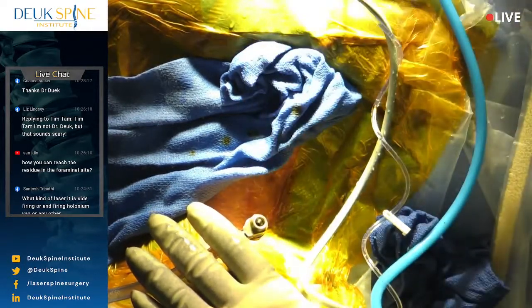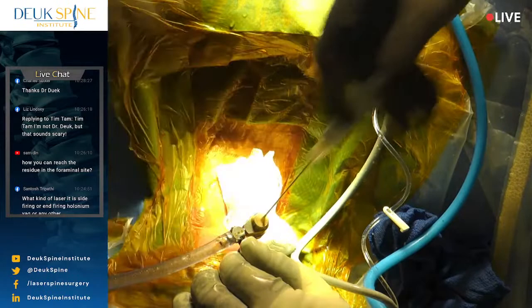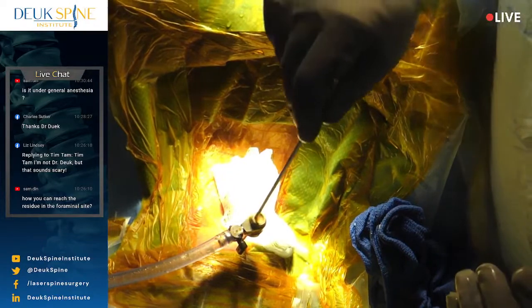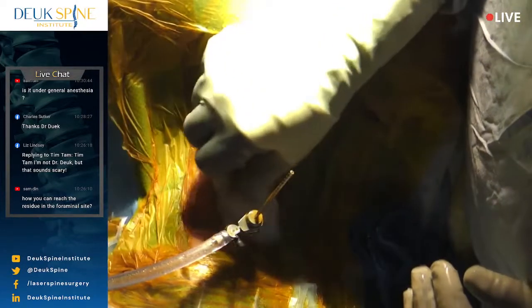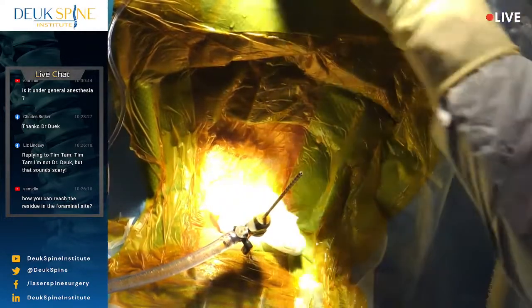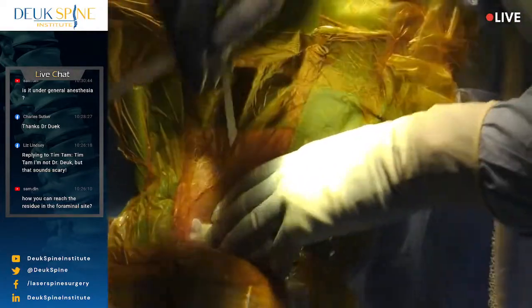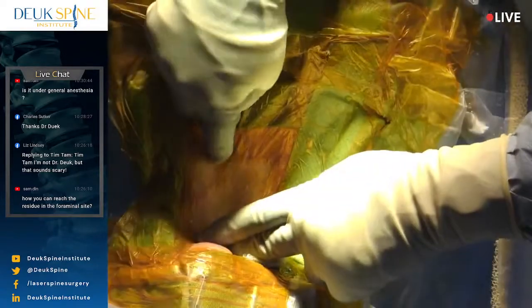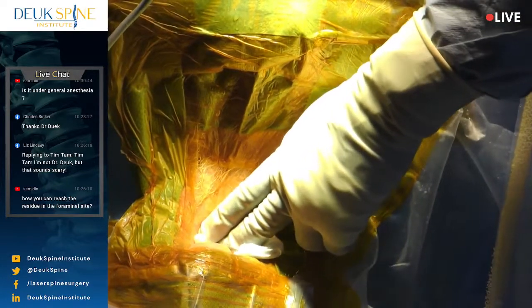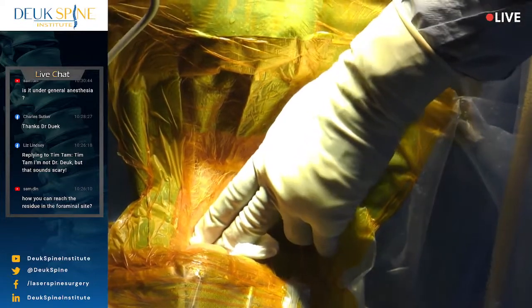Normally at this point when I go to disc two, it's adjacent to disc one that I'm fixing, the first one, but not in this case. The disc that I'm fixing now is literally miles away, figuratively. So I'm going to take this out completely. Normally I walk this down to the next disc, but since the next disc is so far away, I can't do that. It wouldn't be safe. And I can't do this through one incision. I have to do two. I told the patient that I would have to use two incisions. They understand. But I'm going to show you this incision in a minute.